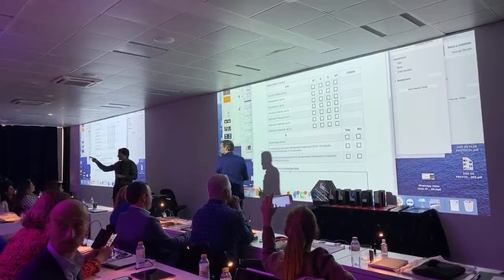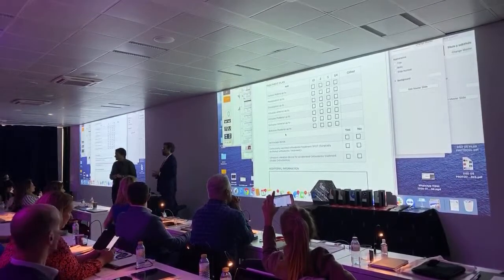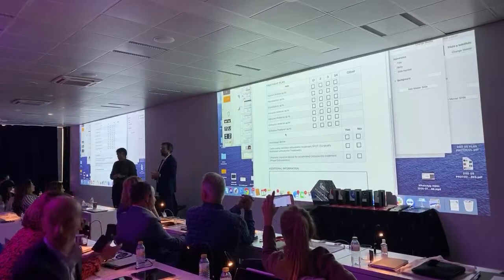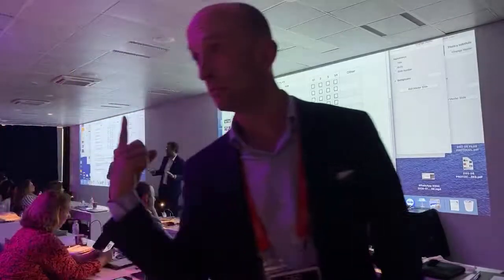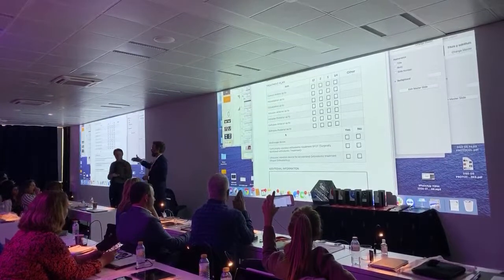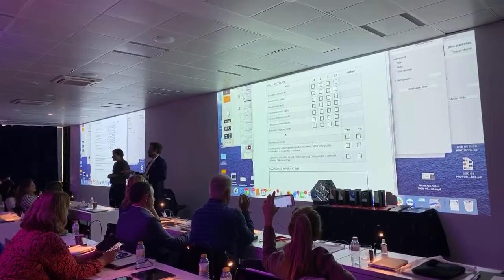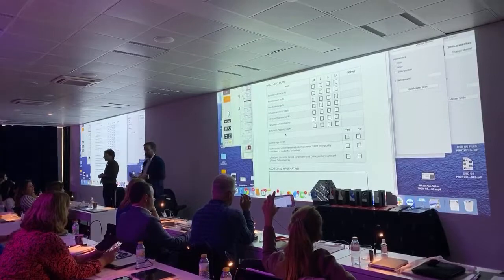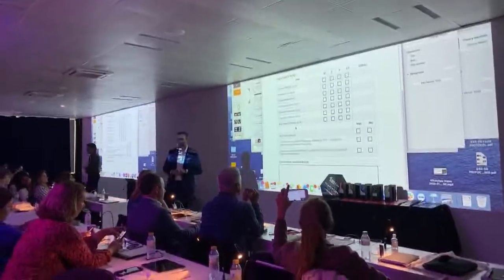Are we going to have the possibility to add quality control final with Invisalign? Yes, quality control is always an option, anytime. It doesn't depend on Invisalign. Anytime you want, you can scan your patient in the middle or at the end and send it to us. We overlap, we compare, we send you the images, and you decide: continue ortho, stop, it's enough, fine tune, change the path. Quality control is always an option.